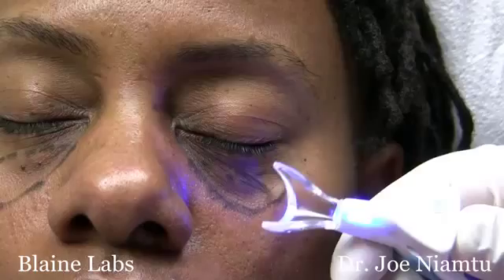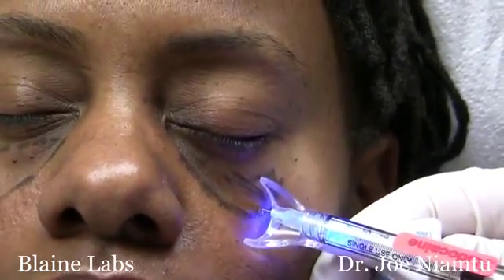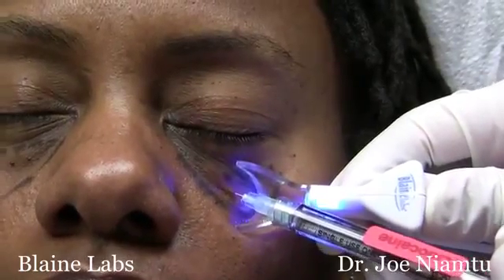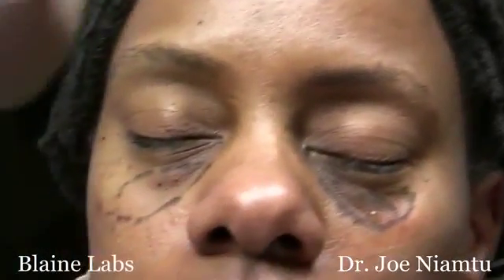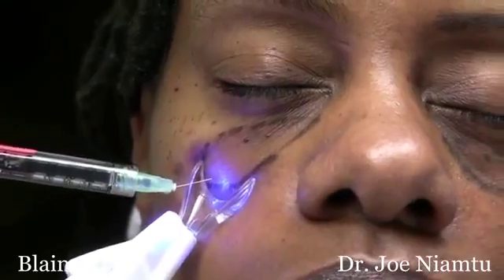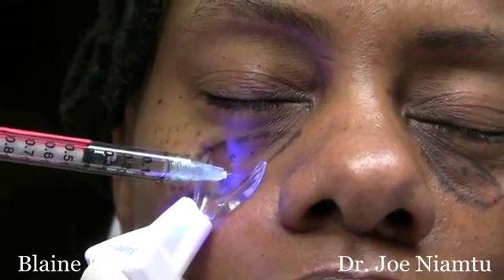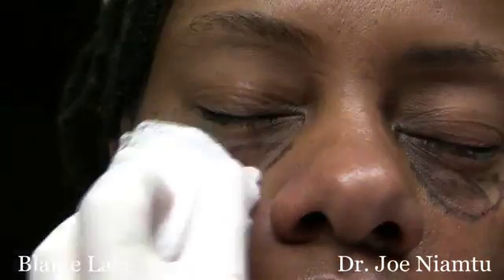I'm going to tell the patient that she's going to feel some vibration, and we're going to insert this. I usually put about 0.1 to 0.2 cc's of local anesthesia in these areas. We're going to go to the other side here. So again, the vibration helps as a distraction, and it also helps as a physiologic example of the gate theory of pain control. So that's this application for local anesthesia.